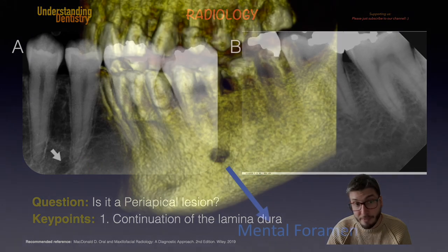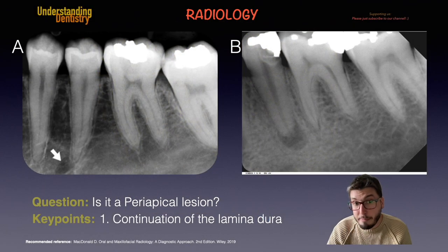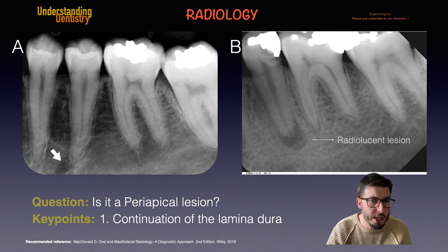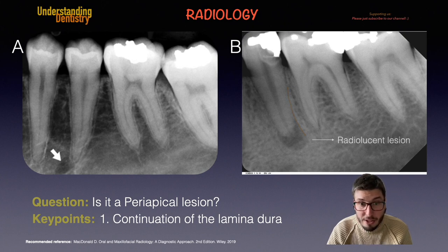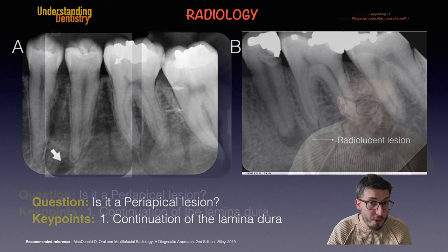The white arrow is showing the mental foramen, which is actually the expected location of the mental foramen on periapical radiographs. On radiograph B, however, we do have a radiolucent lesion. Following the shape of the lamina dura here, it comes normally from the alveolar crest downwards, but then gets in continuation with the lesion, leaving the apex with no lamina dura. The area marked in red shows the apex of the root with absolutely no lamina dura there.